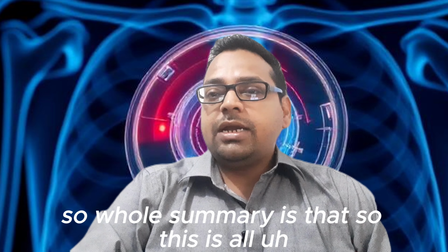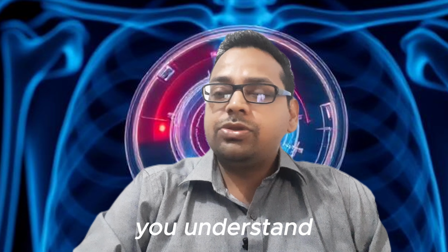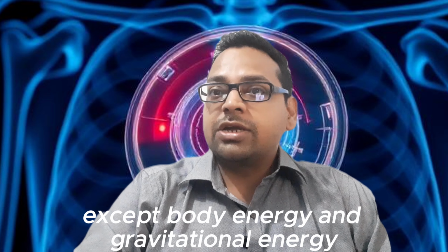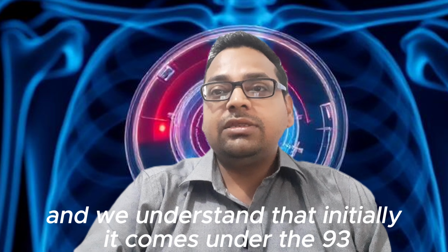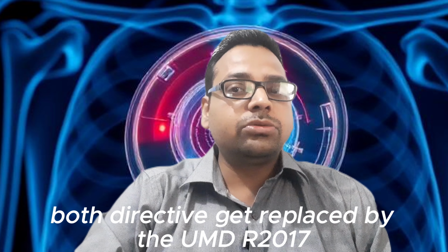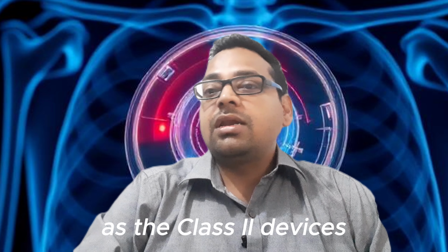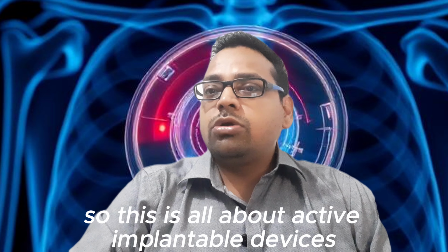So the whole summary: this is all about active implantable medical devices. You understand what they are: they utilize every energy except body energy and gravitational energy. Initially they came under 90/385/EEC and 93/42/EEC, but right now both directives have been replaced by the EU MDR 2017/745, and they have the same requirements as class 3 devices. So they are equivalent high risk devices.